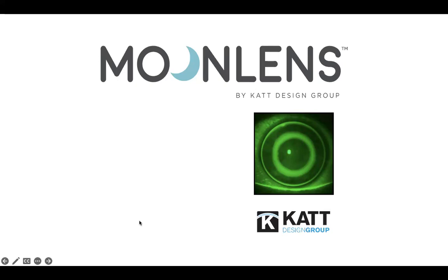Dr. Mohevi. So the suggested sleep wear of the lens is going to be 8 hours. 8 hours is the standard, a good time to be with the lenses.